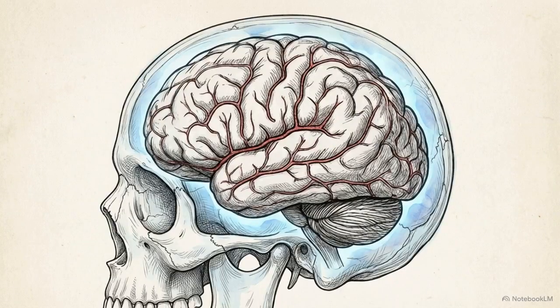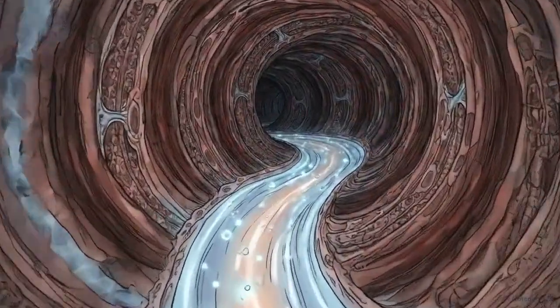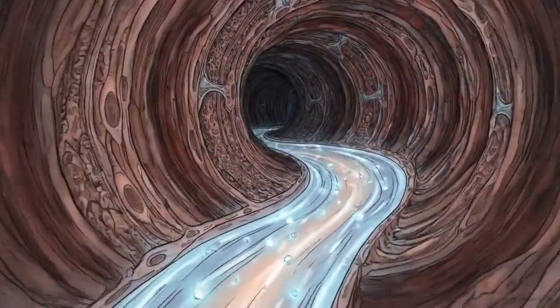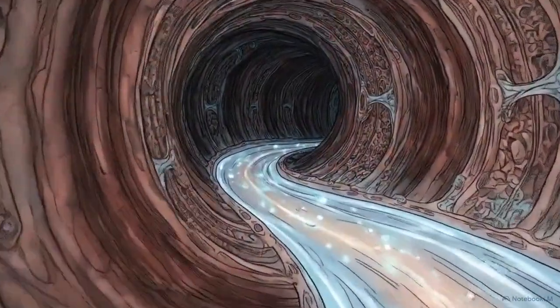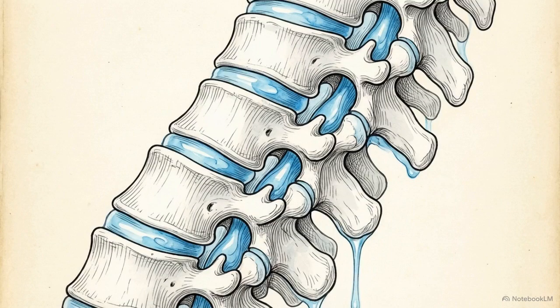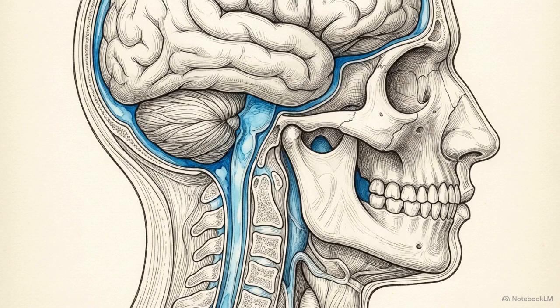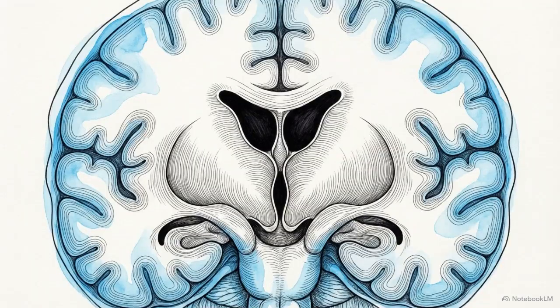Beyond the deep tissue, we also track the fluid dynamics of the compartments surrounding the brain. This requires bypassing the bloodstream altogether and using intrathecal administration, a lumbar puncture, to inject a strictly hydrophilic tracer, like indium-111 labeled DTPA, directly into the cerebrospinal fluid. The tracer maps normal CSF flow, at 4 hours reaching basal cisterns, by 24 hours washing over convexities. There is one critical rule in normal compartmental dynamics.